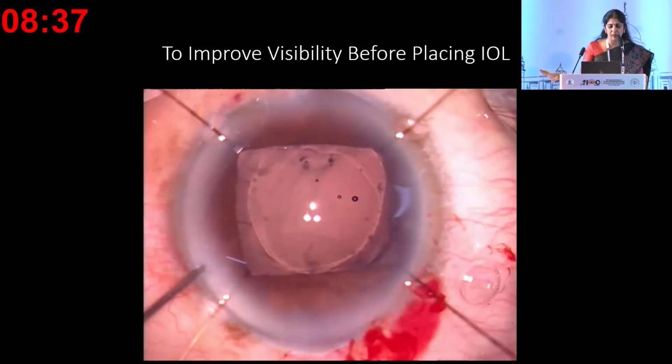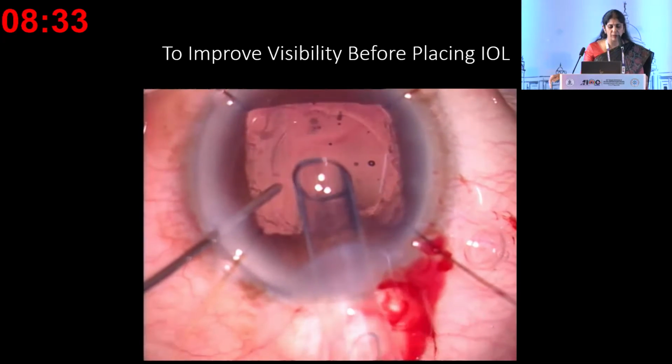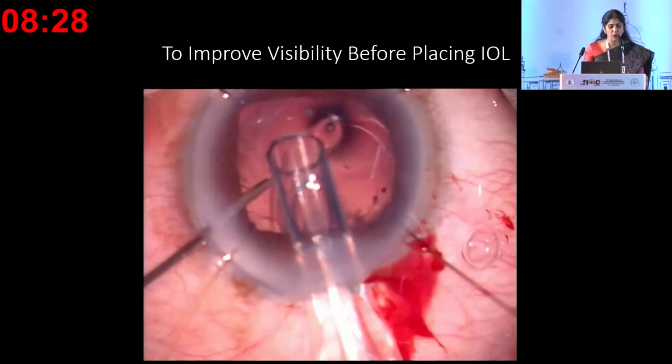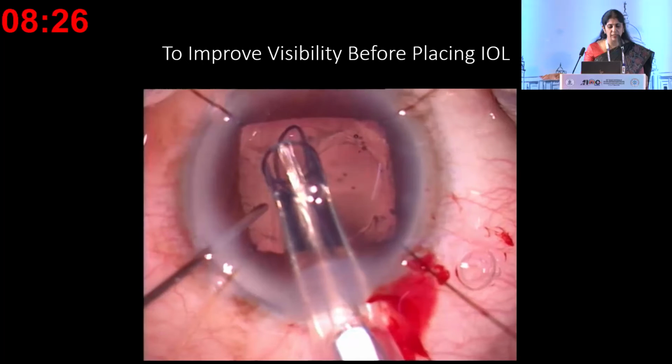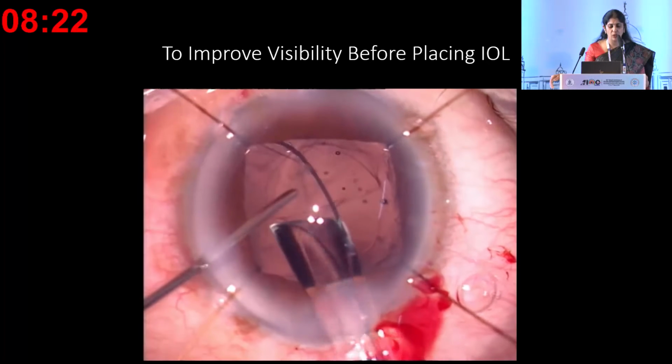I think more than in regular phaco, when you have a patient, almost always the pupil comes down. So use the iris hooks once the vitreous is removed. This way you lift the iris, so you have enough space in the sulcus to place the IOL comfortably. And the anterior capsule rim is also visible well.